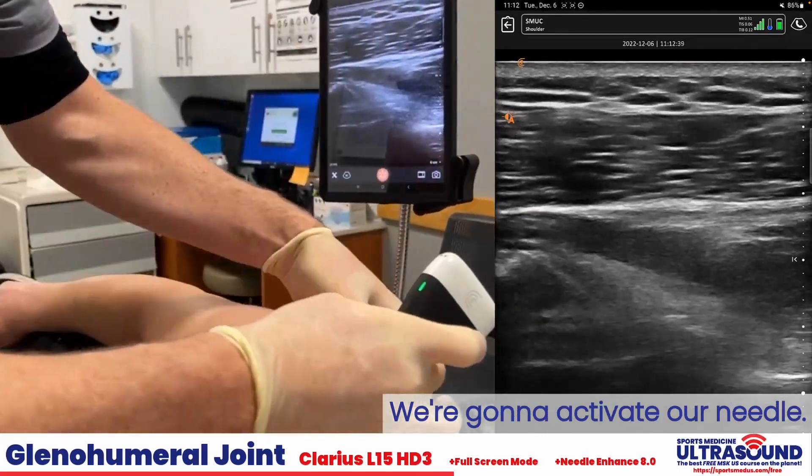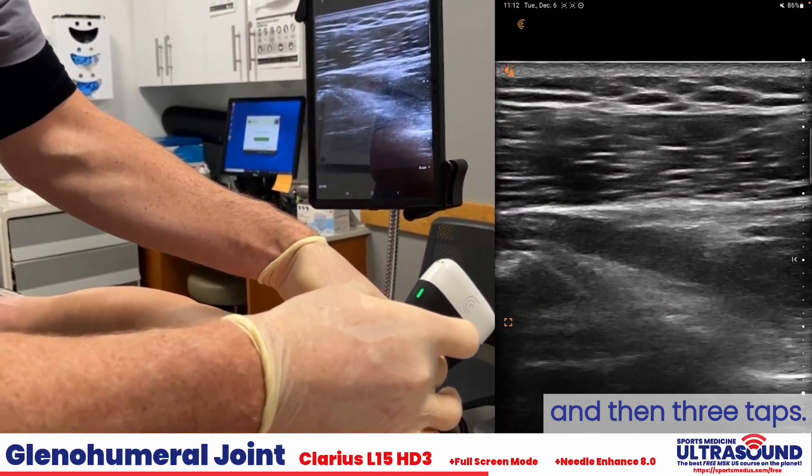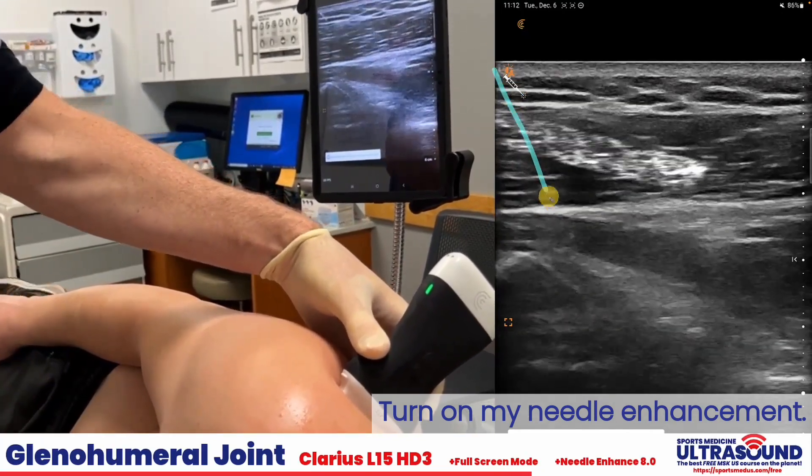It is going to be coming from this way. We're going to activate our needle. I'm going to go full screen and then three taps, ensuring needle enhancement is on.